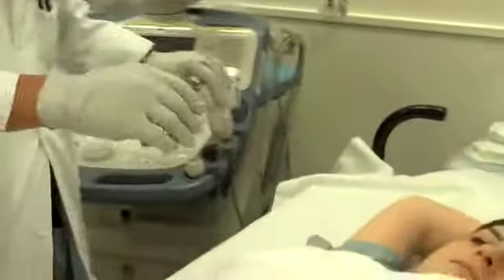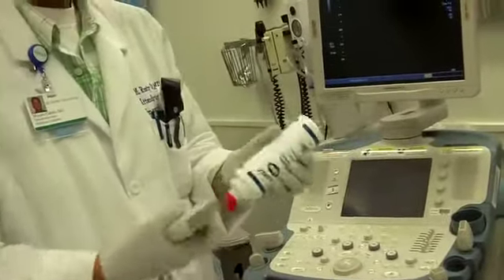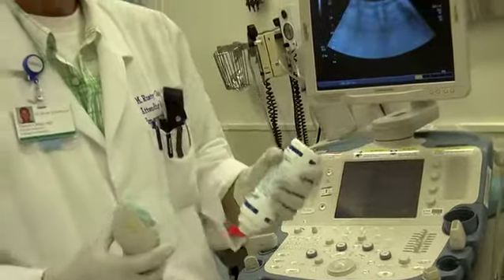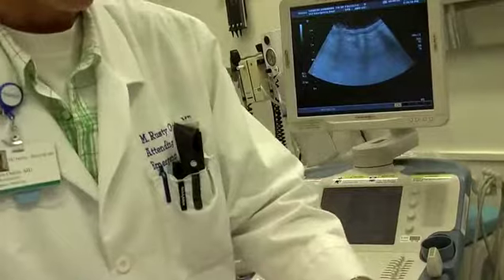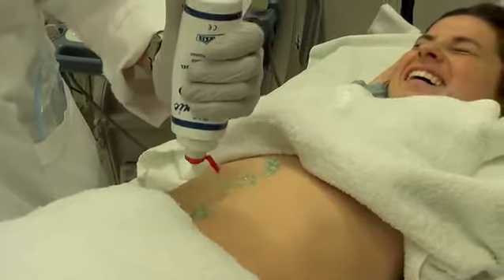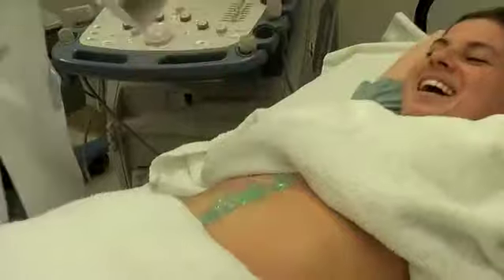Here is one of the times where you want to use a liberal amount of ultrasound gel. We're going to start high up in the epigastrium at approximately the xiphoid process. We're going to work our way down to the belly button and the bifurcation. That's a pretty liberal amount of gel. Oh my god. Okay. I agree with Rusty on this point.